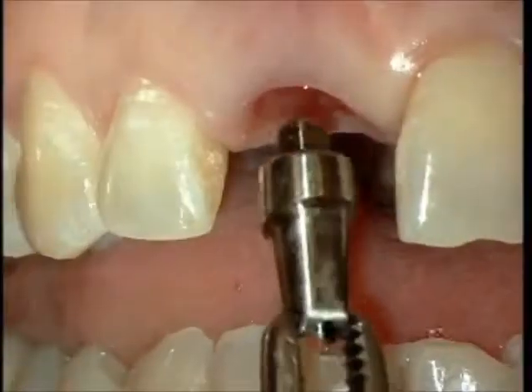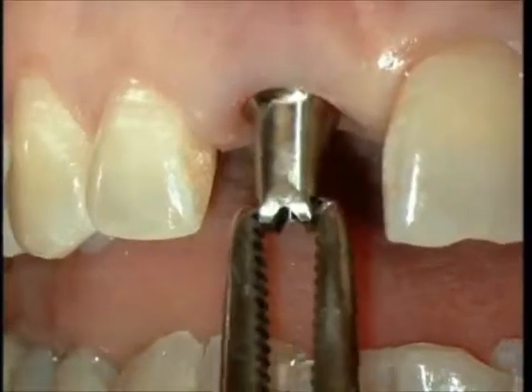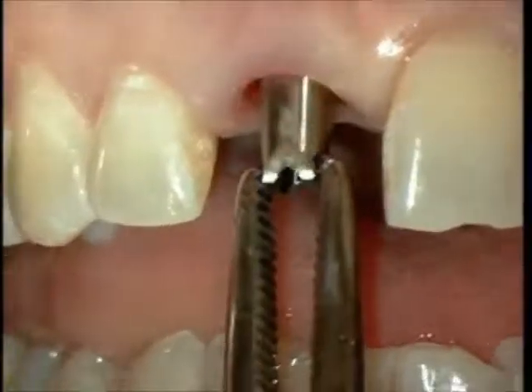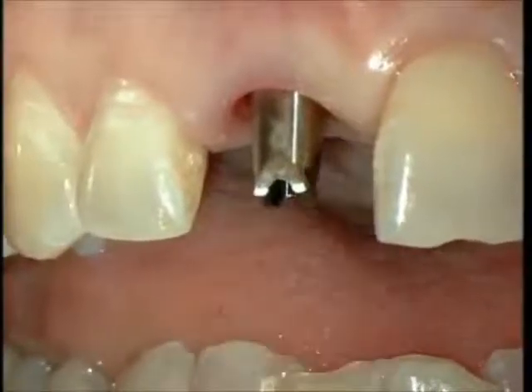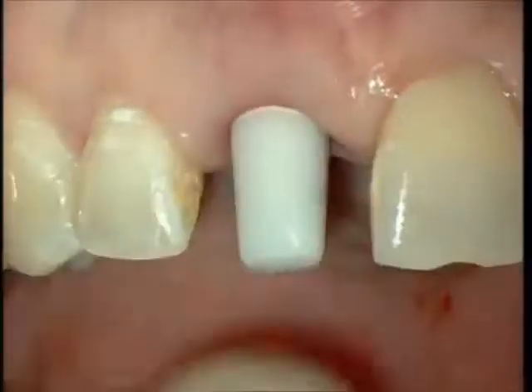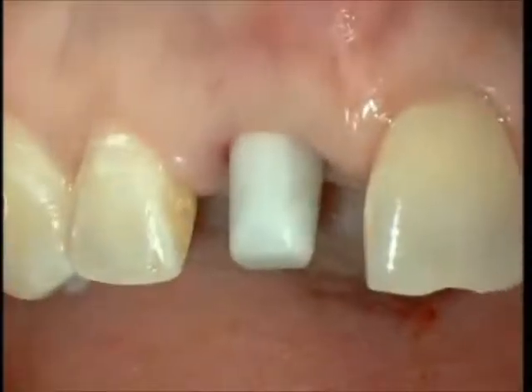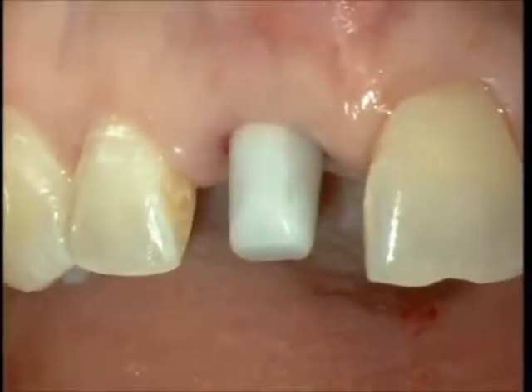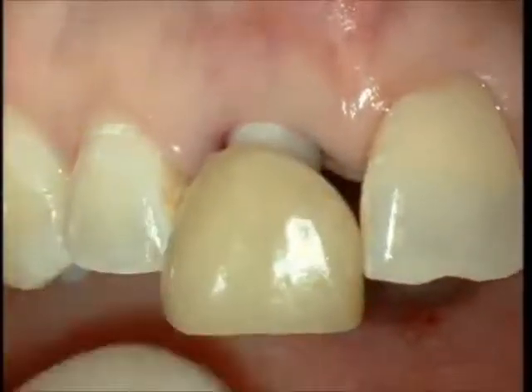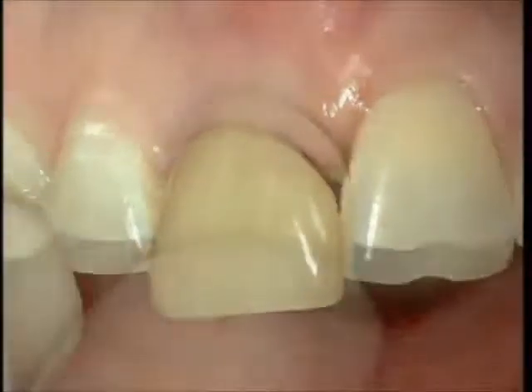To receive the HLA contour abutment, you can see this has a natural contour and anatomy of a chamfer margin that's lower on the facial aspect, and it goes more coronal as it transcends from the buccal to the lingual. The temporary cap now fits directly over that, could be used as a comfort cap, also snaps on, or it can be utilized as a coping for the reline of a temporary restoration.